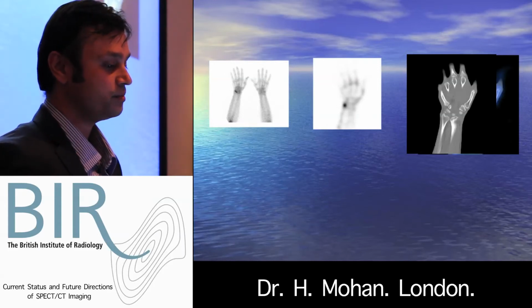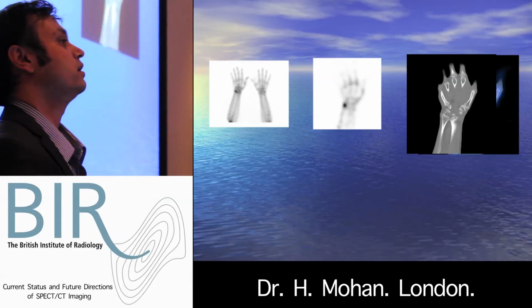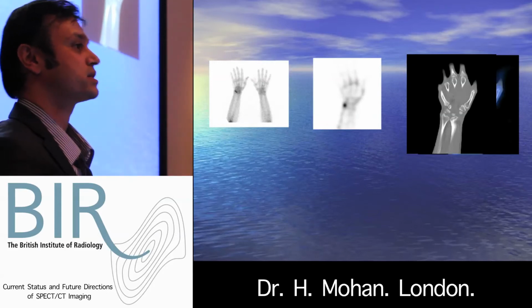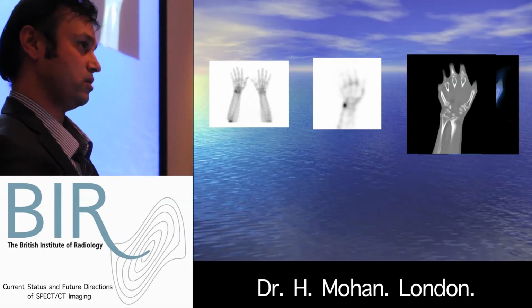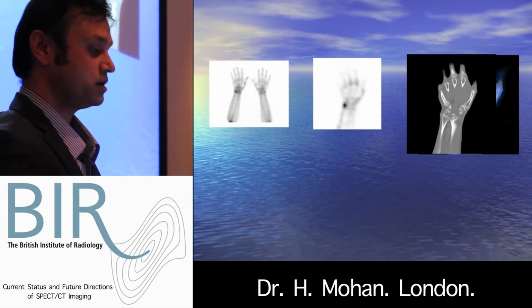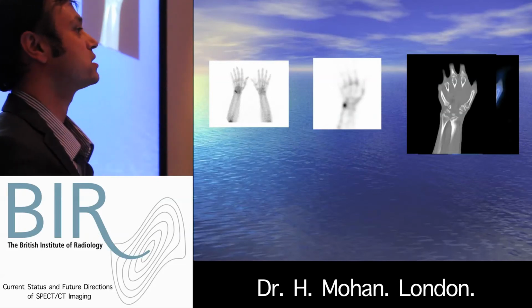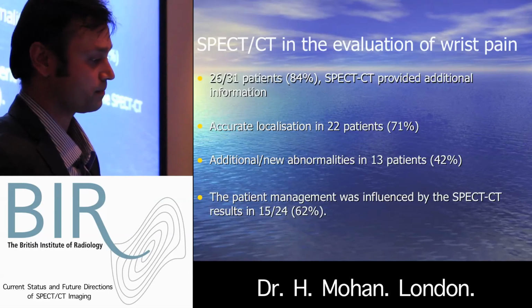On the CT, there is nothing much except for the fact there's an ulnar variance, and again, MSK radiologists will eloquently describe how the biomechanics alter because of this, and therefore that's the site of the origin of pain. So again, as I said, we are drawn out of our comfort zones to try and make these kinds of diagnoses, like ulnar abutment in this case.